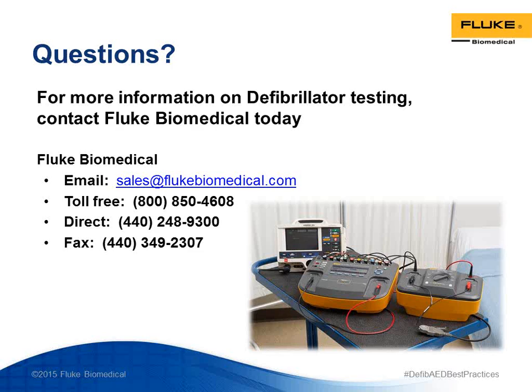Fair enough. Here's another question for you. Are you saying that AEDs should be tested 2 times, or are you only recommending 2 times? Well, all we can do is recommend. What we're saying is go look at the manufacturer's recommended inspection procedure, but also look at that with the understanding that FDA is tightening the screws. They are making the requirements stricter, and as a result, your requirements should also become stricter. You'll never go wrong testing more frequently than the manufacturer says you have to.